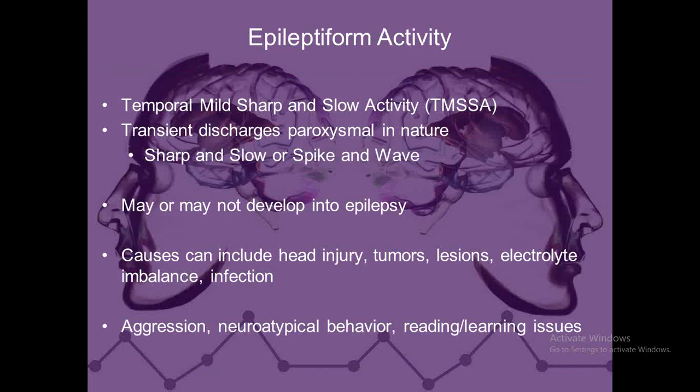Now, this is my area that really got me involved in doing EEGs and qEEGs. I did the first 350 or so with Dr. Jonathan Walker, and pretty often he would come up and say, we've got spike activity, spike and wave activity located, and give me the location.